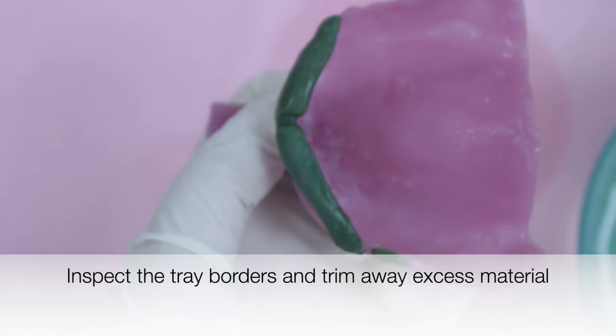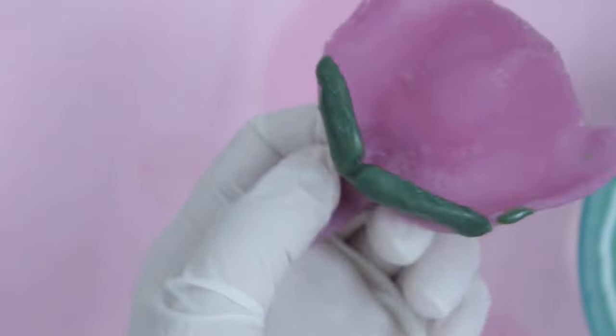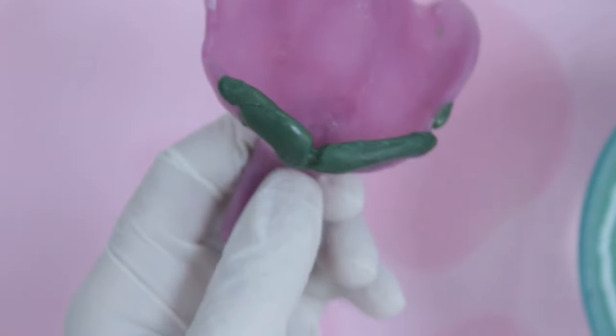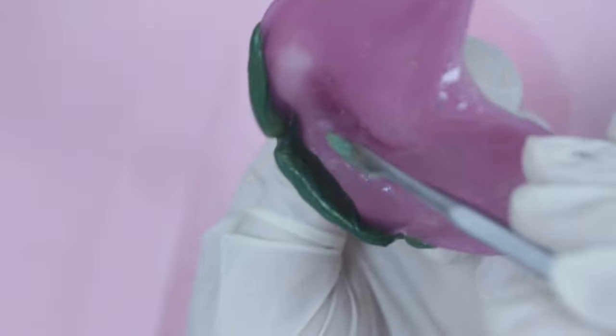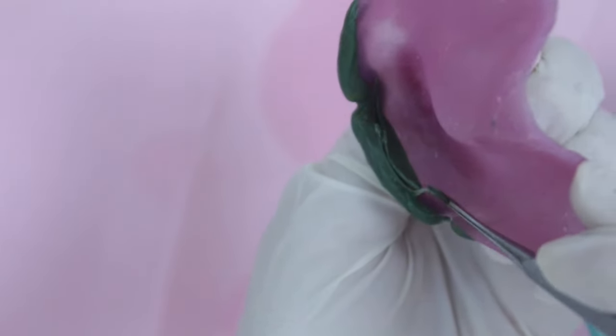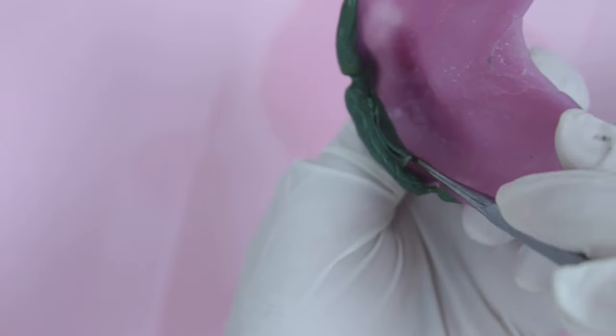Inspect the tray borders under good lighting conditions. Notice how the material has lost its gloss, turning dull, indicating that it has made proper contact with the tissues.